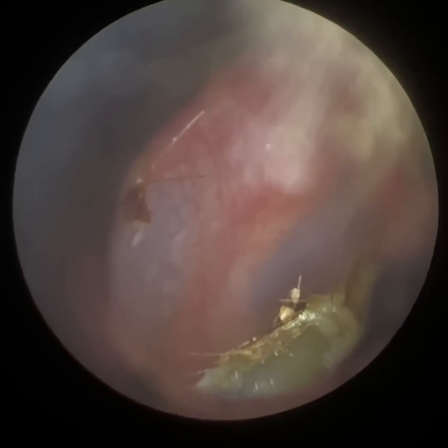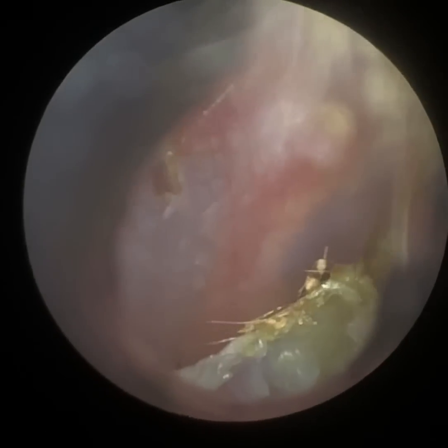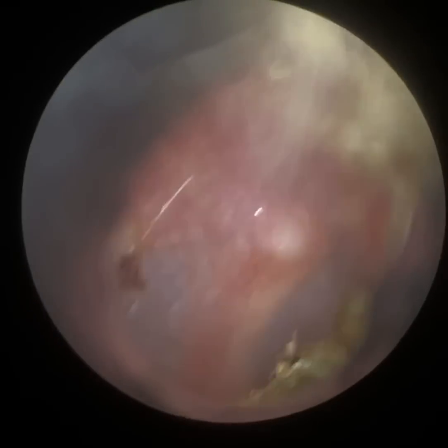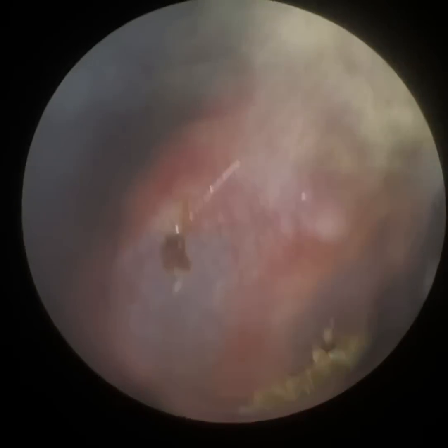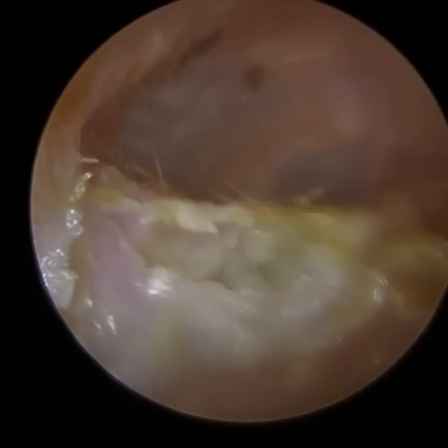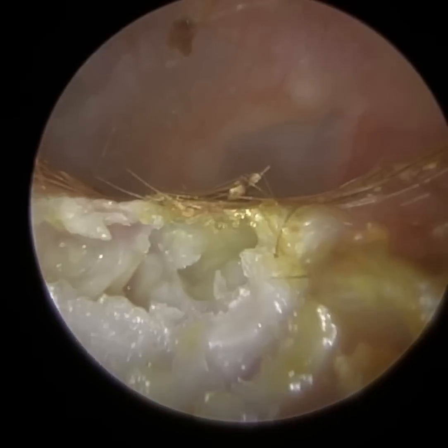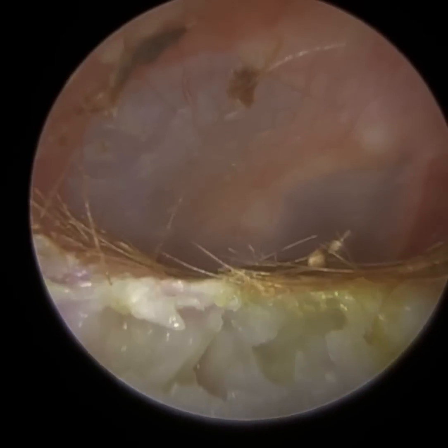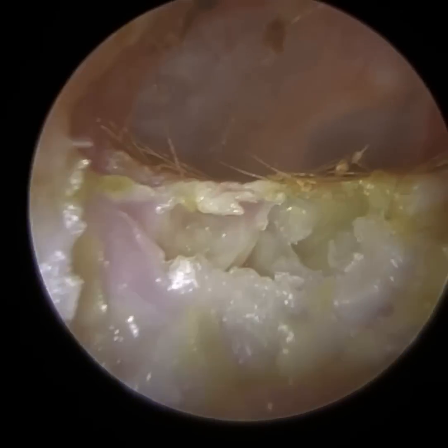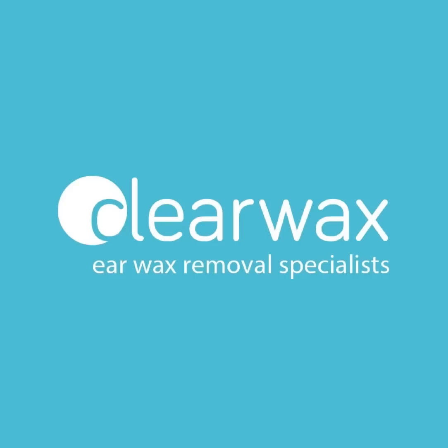You can see the eardrum there — it's nice and healthy itself. That's the exposed bone area. There's some embedded keratin just on the cliff side of it, but I don't want to go into that because it felt a bit unstable. We've given an ENT referral. Here's the endoscope view — you can see it's a lot wider, but the view is very similar to the Waxscope in that sense. You can see all that erosion of the bony part of the ear canal. I hope you enjoyed that video. If you are interested in the Waxscope or the iClearScope, please email info at clearwax.co.uk. Thank you.